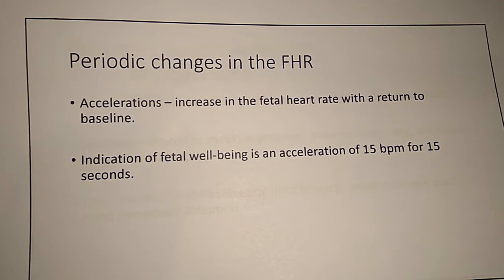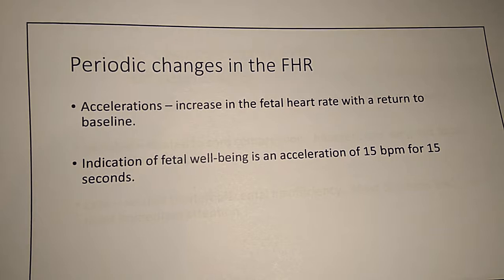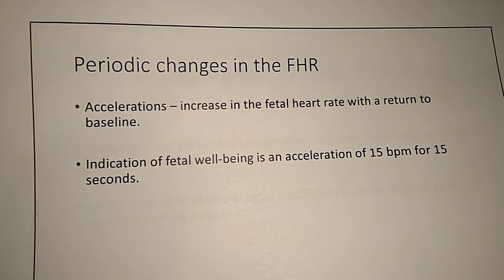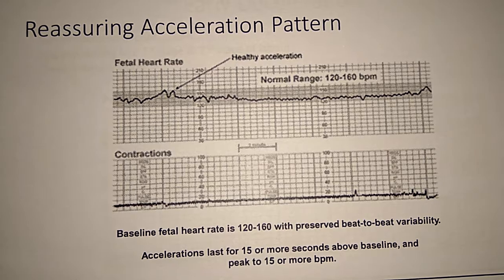The third parameter is the acceleration. Acceleration is an indication of fetal well-being. Acceleration of 15 beats per minute for 15 seconds. This is an example of acceleration.